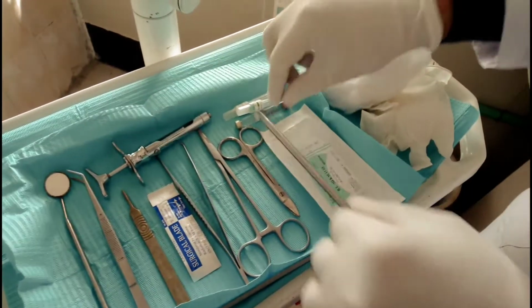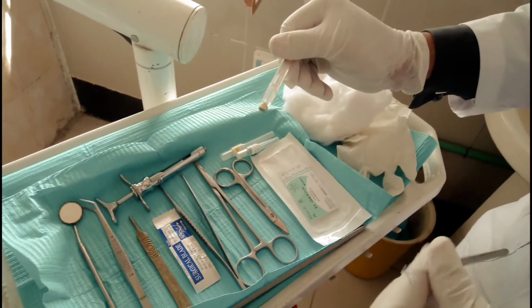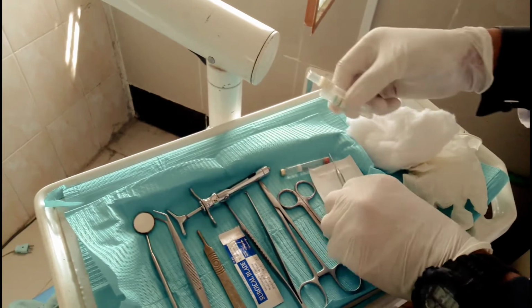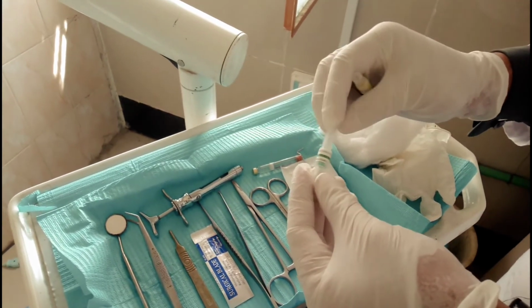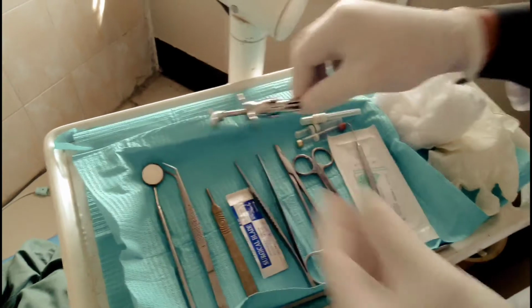And here is the local anesthesia. Lidocaine 36 milligram, along with epinephrine. These are the 2 needles. This is for the block, 27 gauge, and this is for the infiltration. It is also 27 gauge. And this is the dental injection.